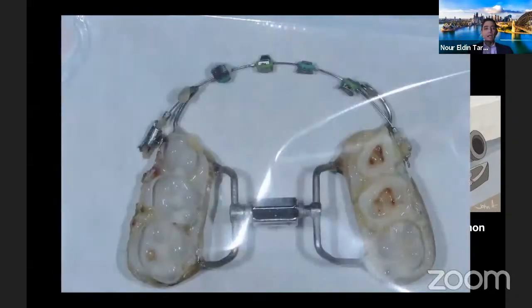So what you find a lot of the time when you remove an expansion appliance after treatment is that it actually comes out with the teeth. And so you have to question, well, how well was the anchorage working in the first place?